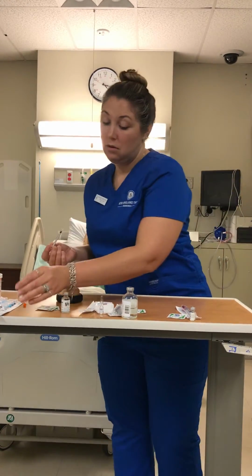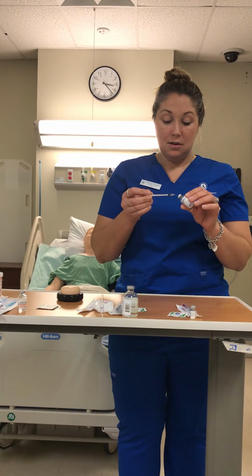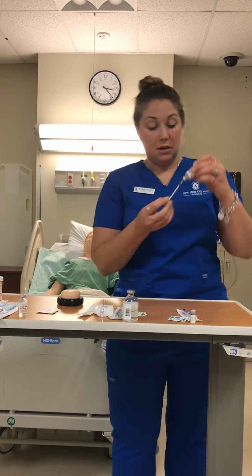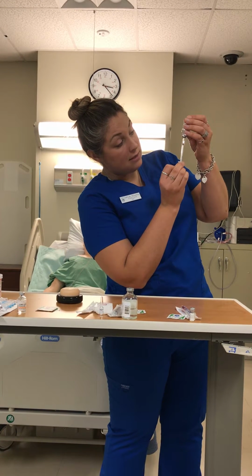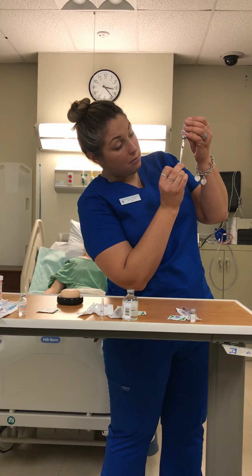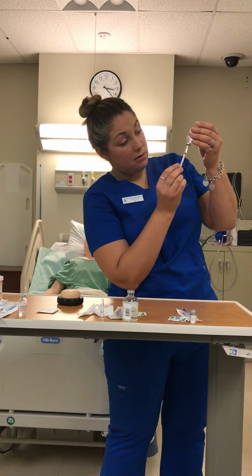Okay. Then you would take the long-lasting one and push the needle in. And this one you want to make sure that you go slow because you don't want to go past the 10 unit mark. And I would suck up to the 15 because this one I needed 10. Okay.